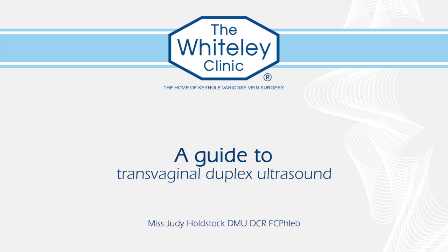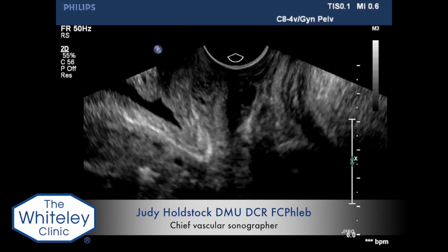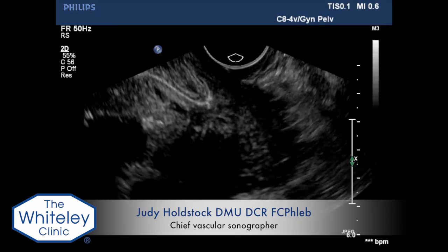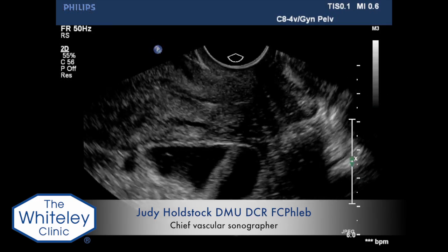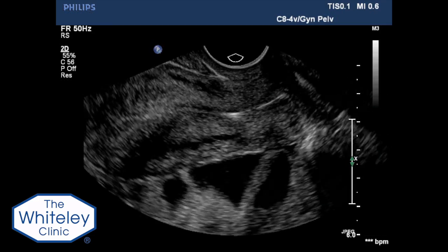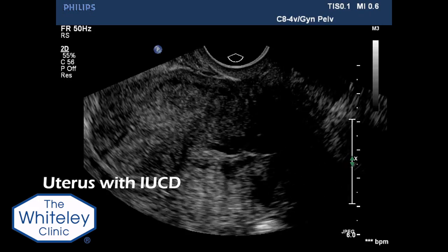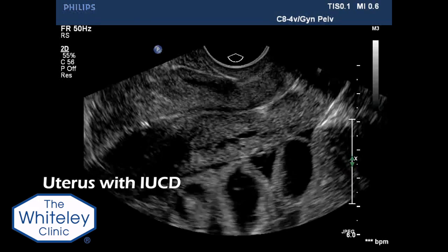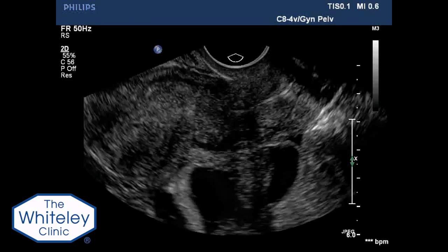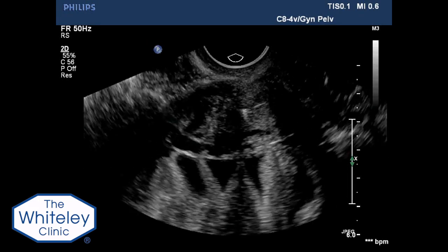Transvaginal duplex sonography is performed with the patient lying on an examination couch with head and torso elevated to 45 degrees. The transducer enters the vagina in longitudinal plane to demonstrate the uterus, seen here with an IUCD in situ.